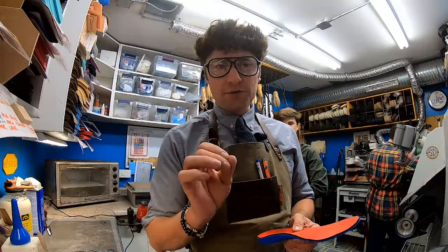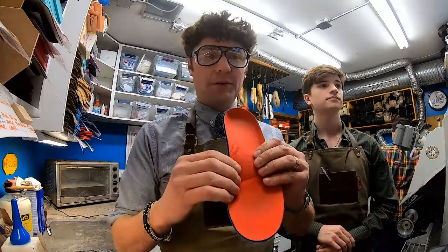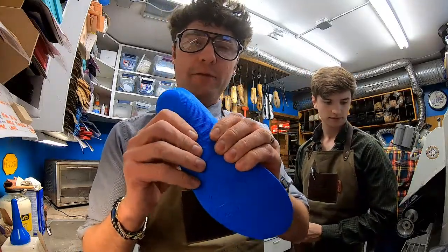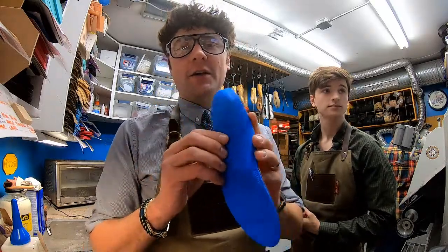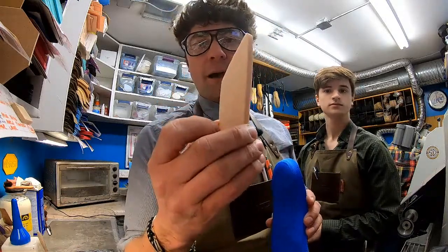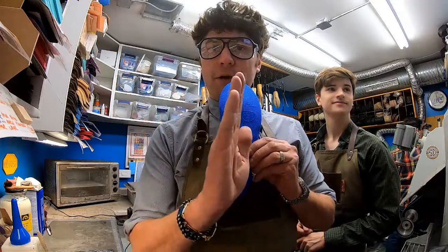We're going to do 2 steps. We want to maintain the contour of this Power Step Plus, but we're going to scoop out the base. We have a firm plate on the inside and a soft EVA foam on the outside. We're going to scoop that out and fill it with a P-cell, about a 20 durometer softer material, and then we're also going to follow that up and shift the pressure more medially.